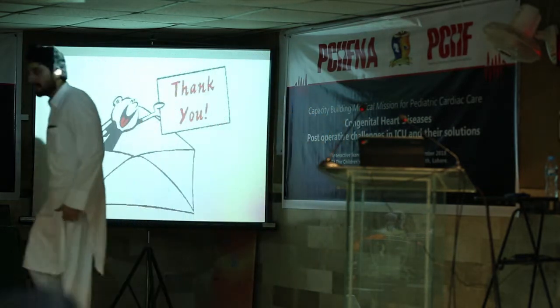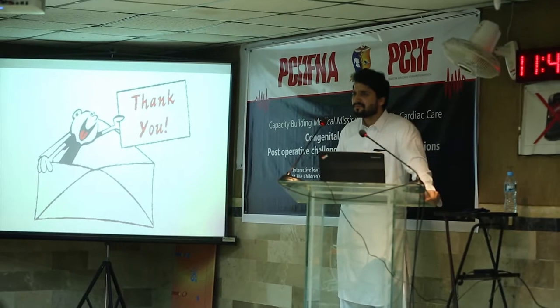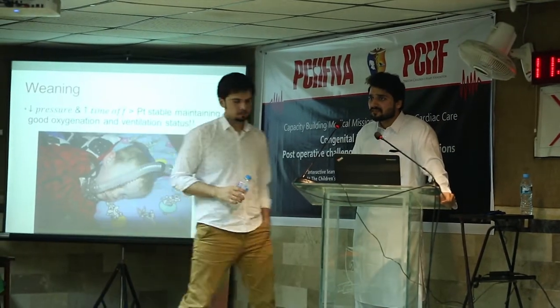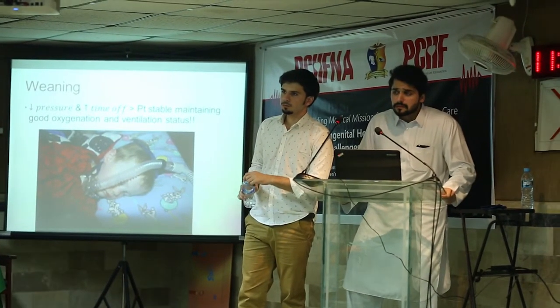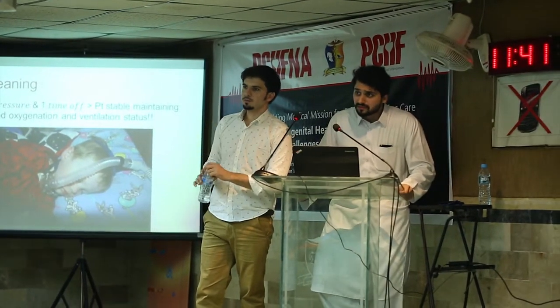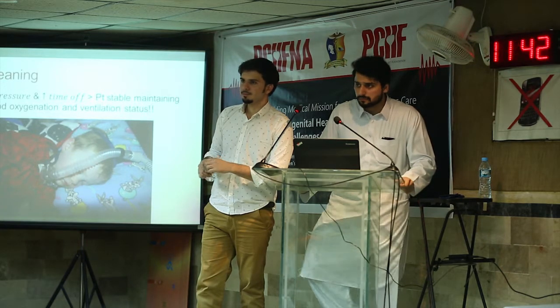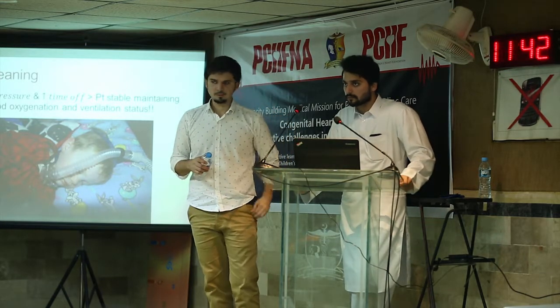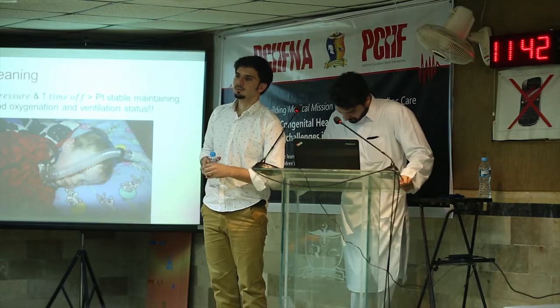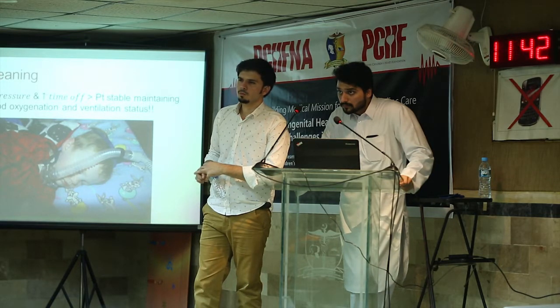I had one or two quick questions. When we say non-invasive ventilation, there's no endotracheal tube. I know there are a couple of centers we visited, especially in India, at Fortis, where the intensivists, it was kind of surprising, had a nasopharyngeal ET tube in place for almost most of their patients, hooked up to a regular ventilator, because the bigger problem we have is that we do not have the BiPAP machines or the CPAP or the Hamilton one that you're talking about. Our neonatology unit has jerry-rigged one, I think it cost 5 lakh rupees, but they have made it locally.